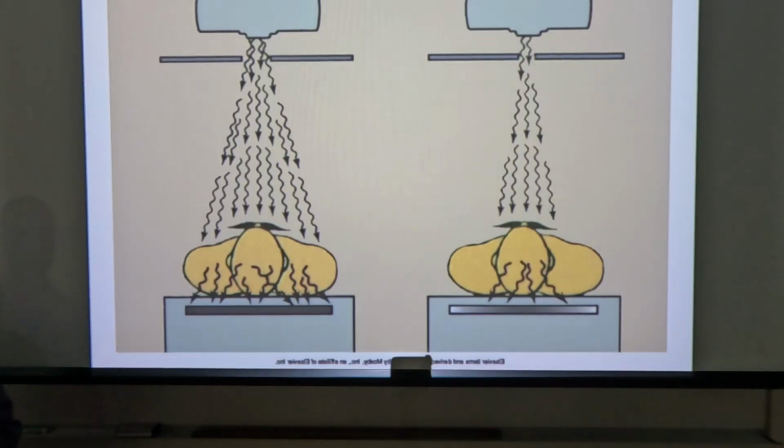We looked at that shoulder from before. If you remember it, there was a lot of direct exposure to the image receptor, right above the shoulder, way out here. You remember looking at that? Okay, so what that tells your computer is that the patient received extremely high dose. So it can't tell that there's not a patient there. It just sees exposure to the image receptor that shouldn't be there, right?